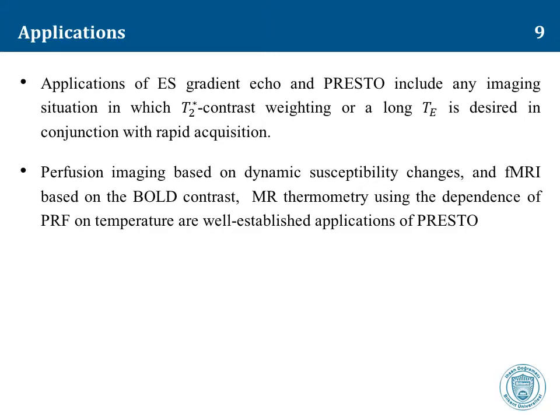Another application of ES pulse sequences is MR thermometry using the dependence of the proton resonance frequency, or PRF, on temperature. Applications of PRF methods include in vivo temperature monitoring during procedures such as focused ultrasound tissue ablation.